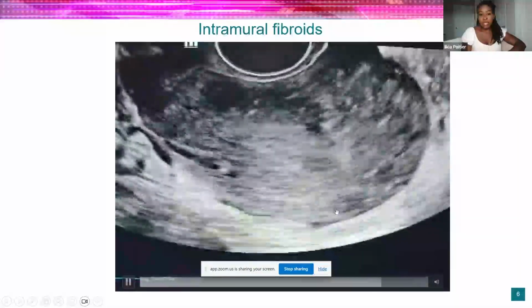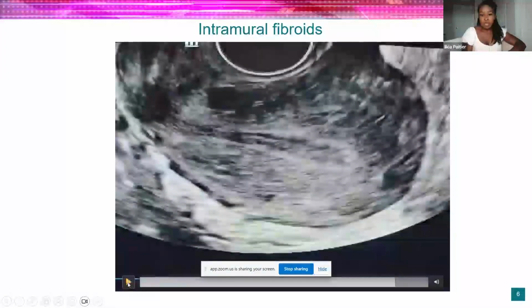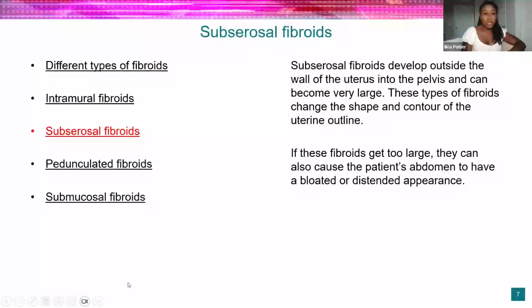And that's how we find our intramural fibroids. So moving on. That was intramural fibroids, okay? Now we're looking at subserosal fibroids.